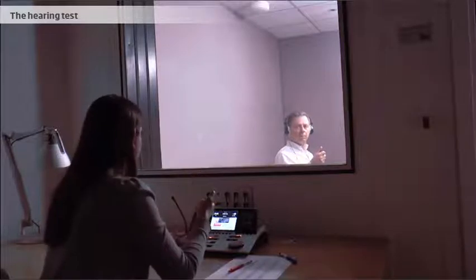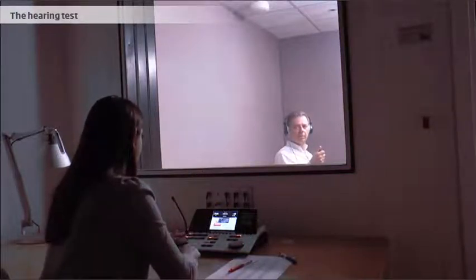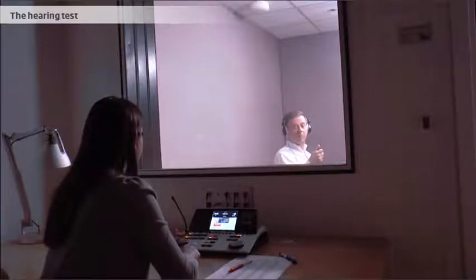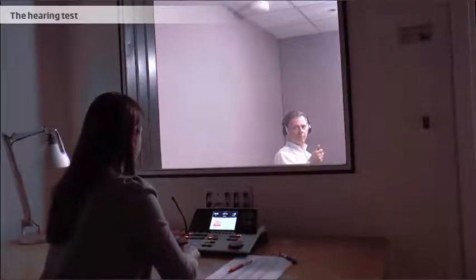The hearing care professional places the headset carefully over the ears and checks that it is placed correctly. It is important that the hearing care professional can see the client during the entire test. The hearing care professional will speak to the client through the headset to re-instruct the client regarding the test and to indicate that the test will begin.